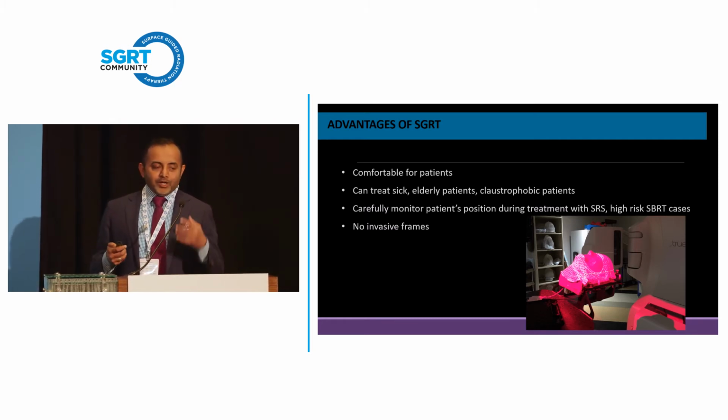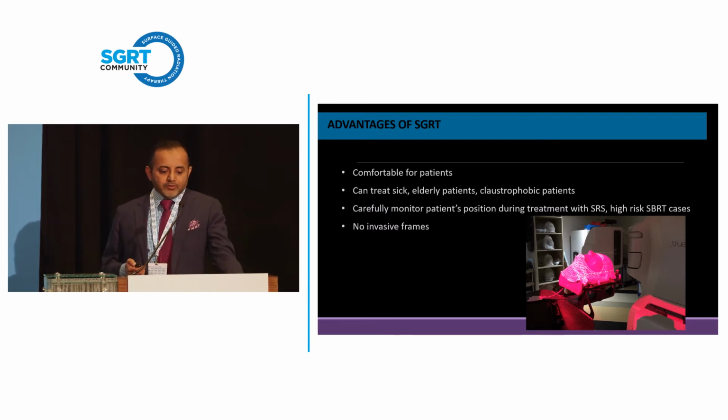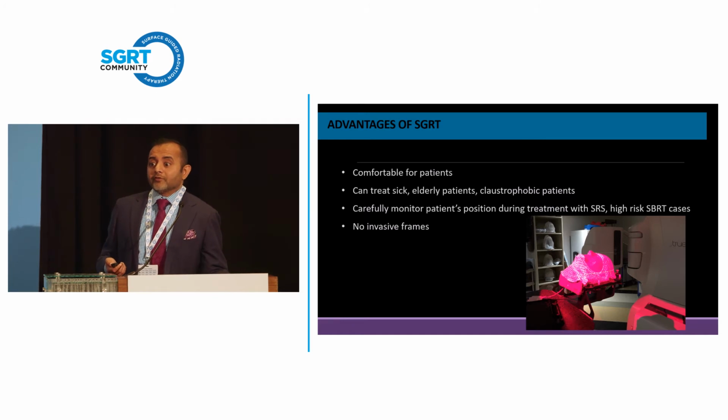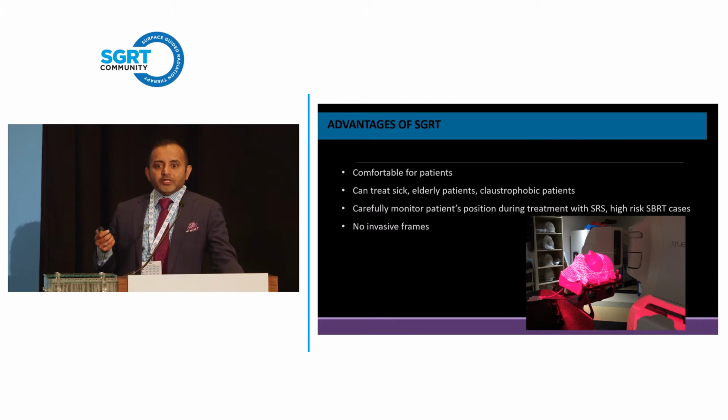And as Maureen points out, the hard table. I can't really do much about the table, but I can do a lot about the head and face when I treat them with radiosurgery. And then you need to be able to monitor these patients. I realize that our treatments are getting much, much quicker. Literally, the beam on time for our average radiosurgery case is on the order of 5 to 6 minutes. But even in this short beam on time, surface guidance really allows you to make sure that you're treating these patients very accurately. And I can't emphasize the frameless, it really has revolutionized the way we do radiosurgery.